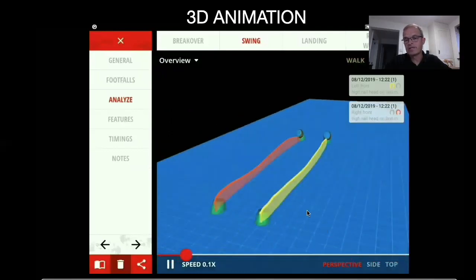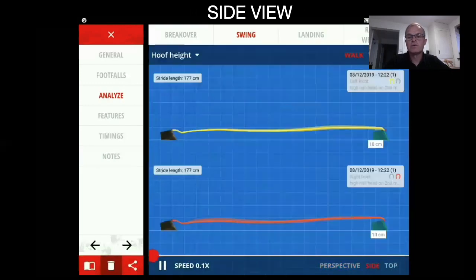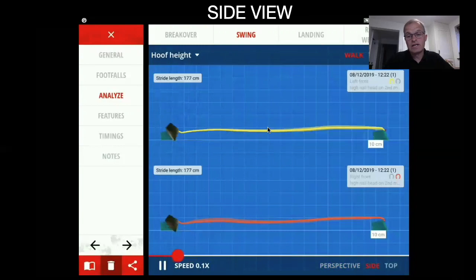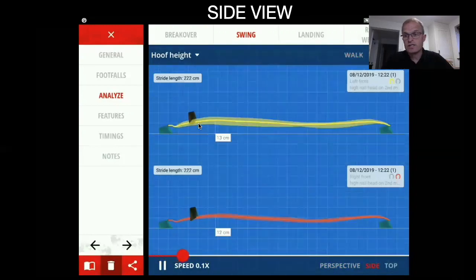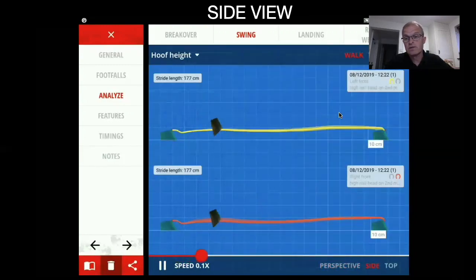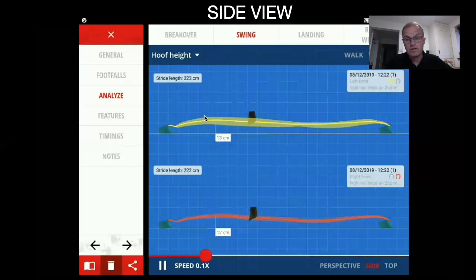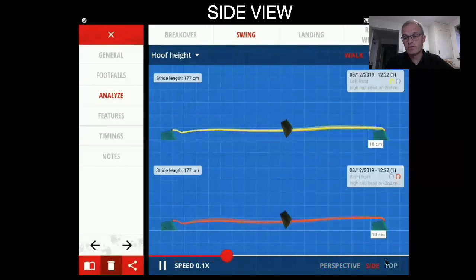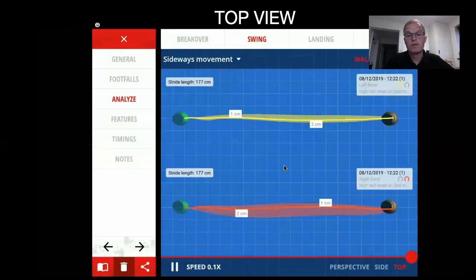So you see along here, we've got perspective, side and top. So this is the side view. This is a little more information here. So we've got stride length, 177 centimeters in walk, 222 centimeters in trot. And I've measured lots of horses, as I said, and Charlie in walk had a very low, flat stride pattern. Some horses like the Spanish horses, as you can imagine, the initial stride elevation is very high. So again, we can see from this line the median, and you can see a deviation from the median line. So the solid yellow line or the red line is the median, and you'll see that from the top view as well. So we've got top view here. We'll go top view, and here we go.